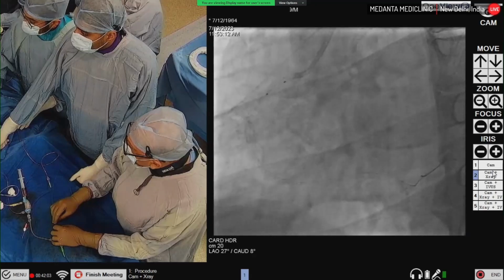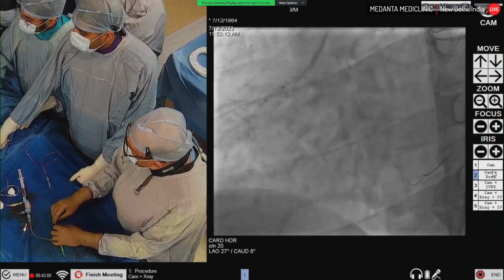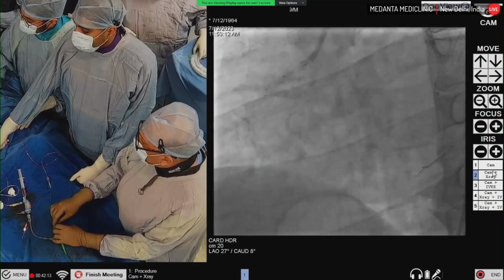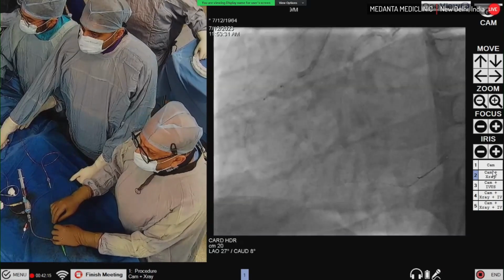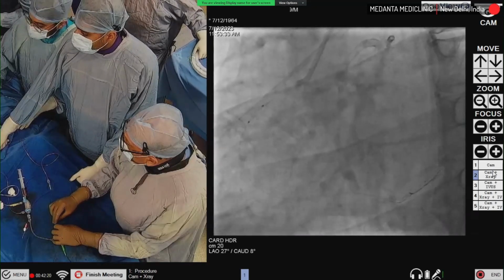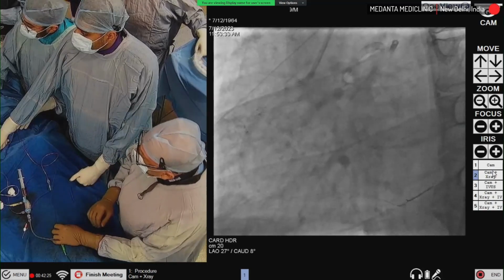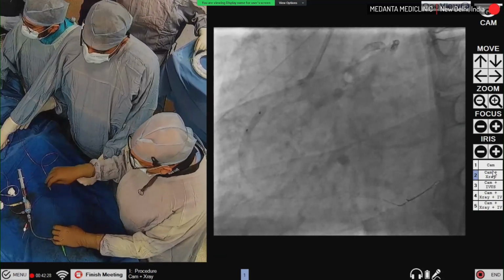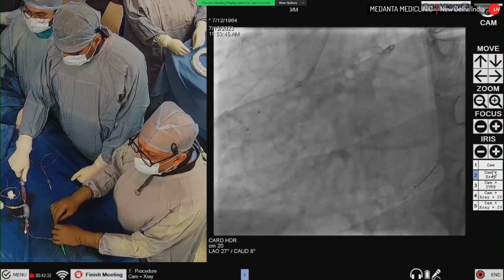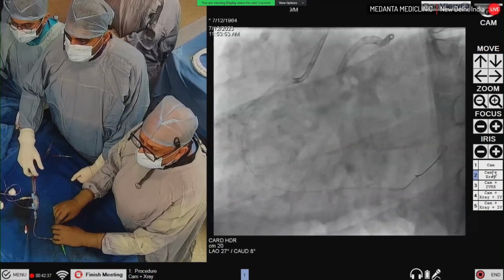Okay. So we are just at the edge. I'll go up here. Go up 2, 4, 6, 8, 9, 10, 12, 14. Okay, 16. Deflate. So the proximal edge is done. I'll go a little bit inside. Okay, 16. 16, please. 18. Okay, fine. So we are done. Deflate, please. Okay. So check now.